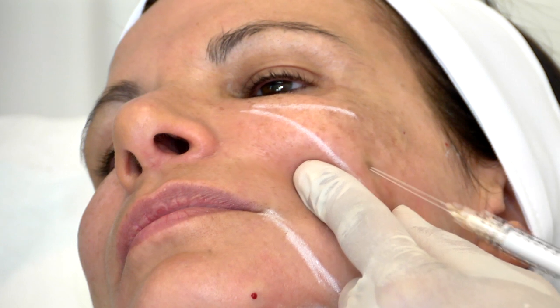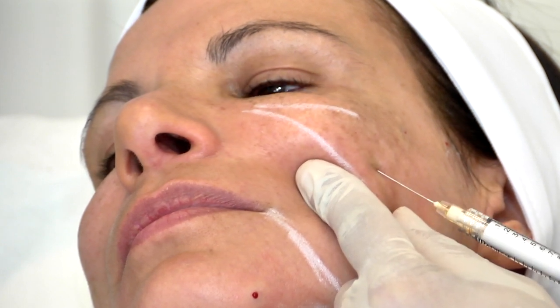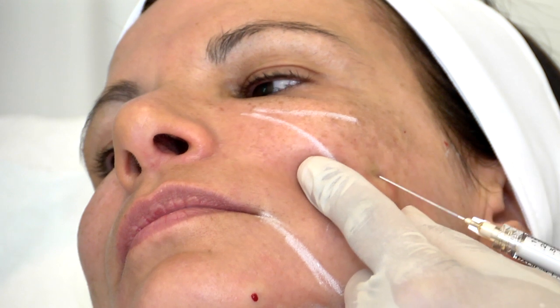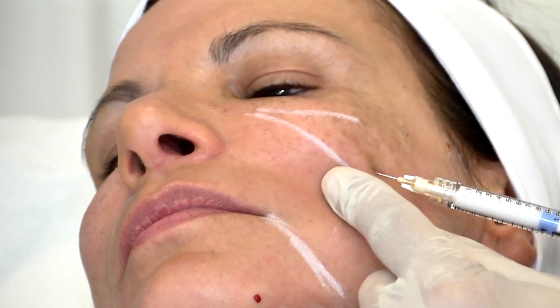Massage and shape the areas injected to evenly spread the product. With Radiesse, the product deposit and correlated correction are assessed immediately. Several fans can be combined, ending with a netting or grid technique if volume restoration requires it.